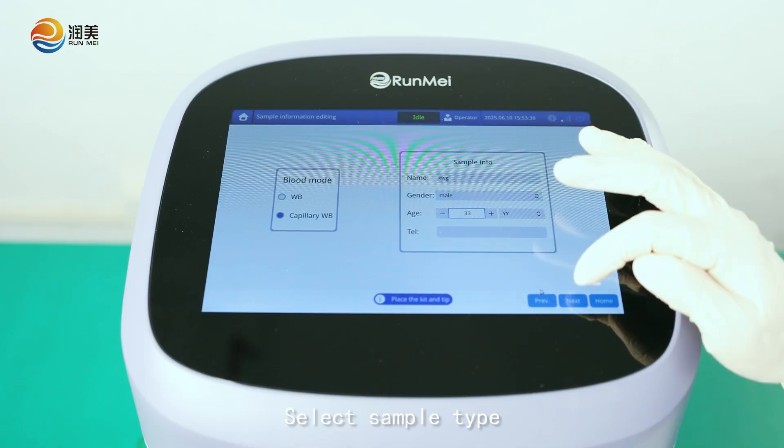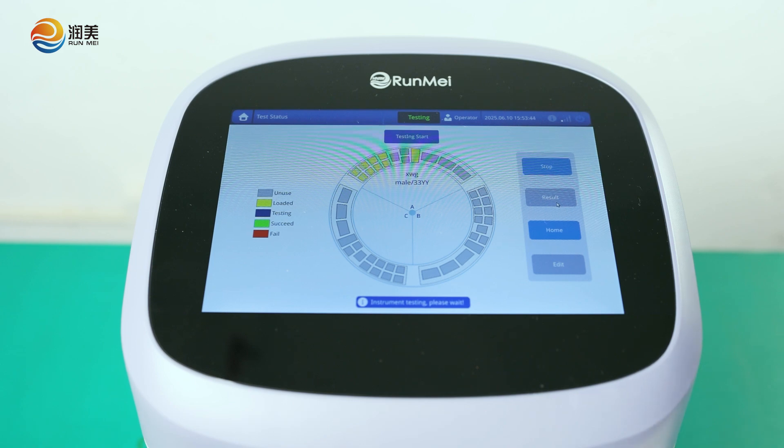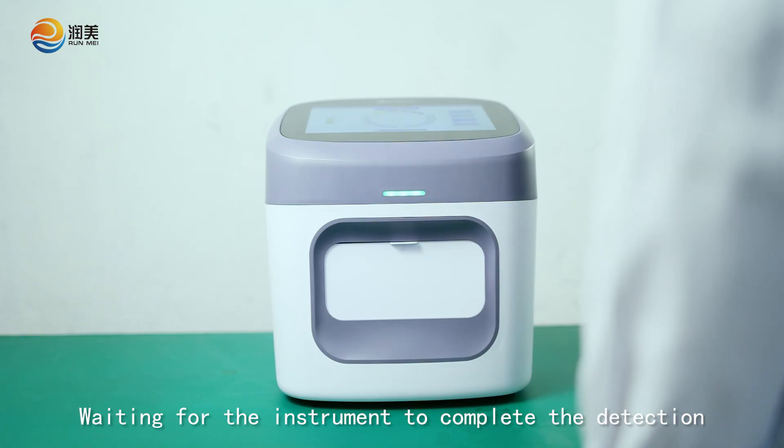Select Sample Type. Enter the patient's information. Click Start. Wait for the instrument to complete the detection.